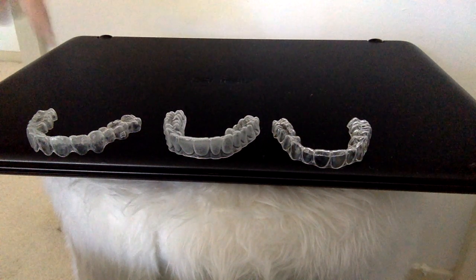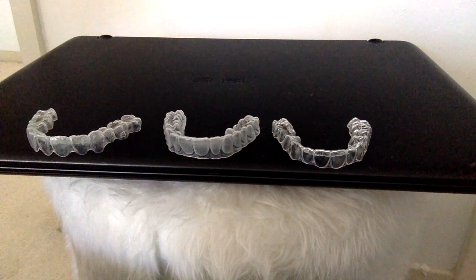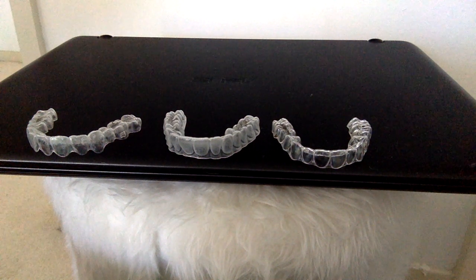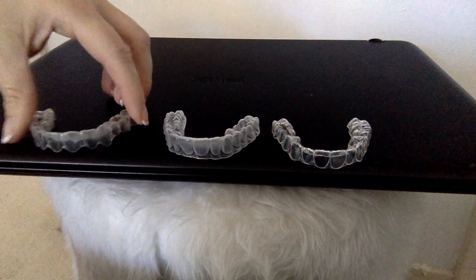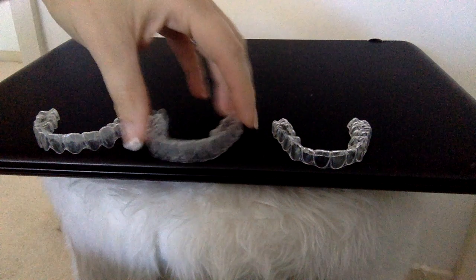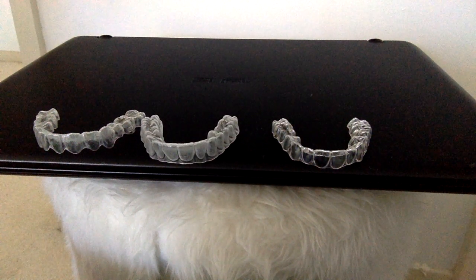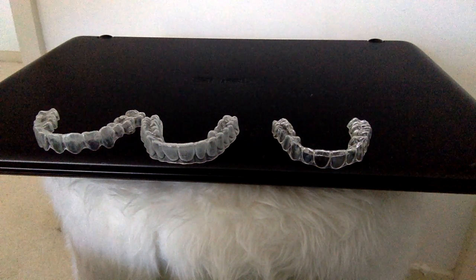So there's a modulus of elasticity to this. Some people think it moves teeth better and faster. Some people think it has more consistent force levels. But there's also a downside to this because of the flexibility of it. See that? There's no way you can do that with this. It's not as good at expanding arches. So, you know, you have to find the right solution for every patient.